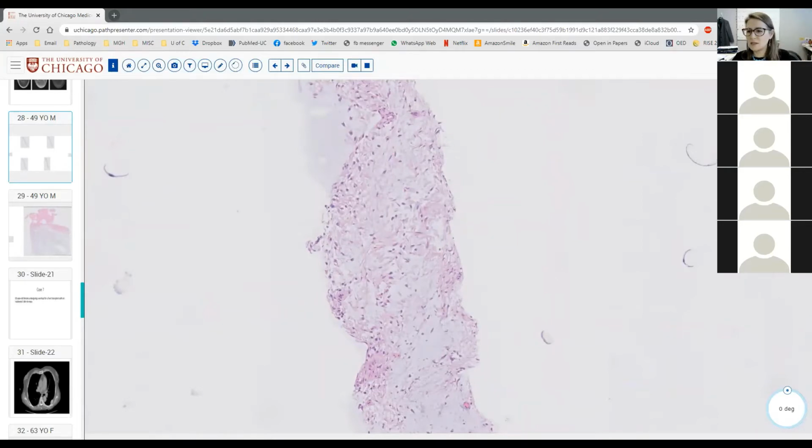No, no. In the muscles, it would be more, I think, intramuscular myxoma. Right. Yes. So where do we normally see angiomyxomas? I think the GYN tract, like vulva. Okay. Like angiomyxoma superficial or deep, I remember that. Where else? I'm not able to remember. Yeah, okay. Anybody else have any comments on angiomyxoma? Just so we can get that out of the way.